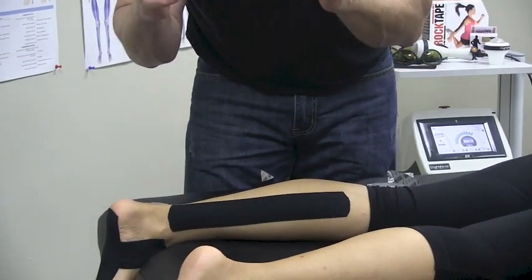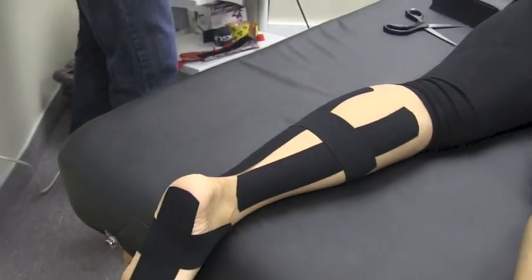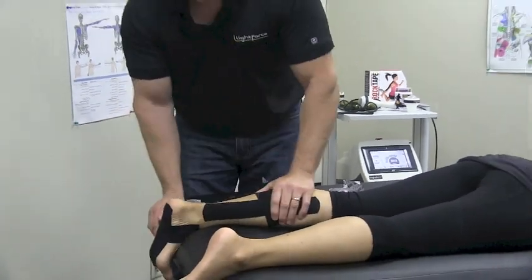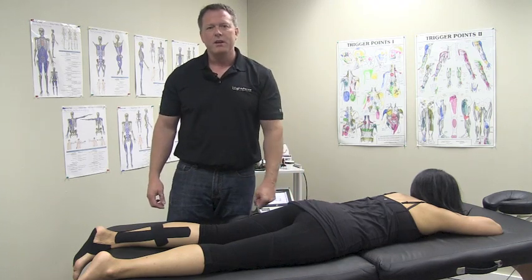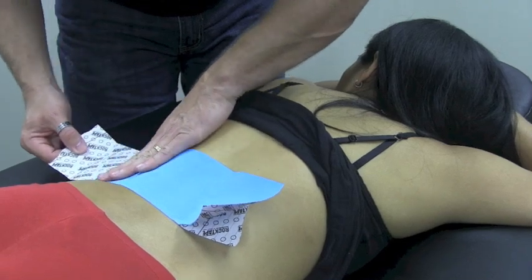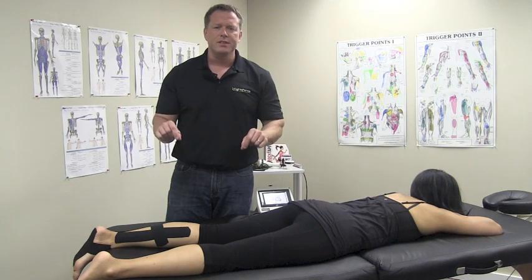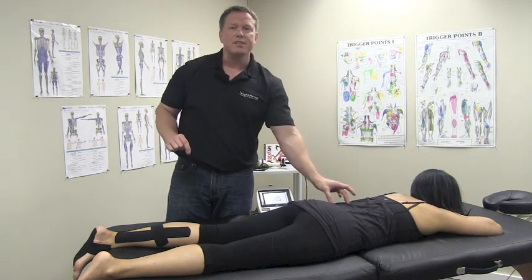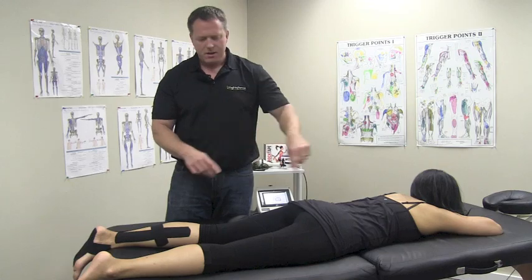Pull a hundred percent, back off half, and place it down. Now they have the support of the tape to give lift and stabilization to the calf to relax the fascia on the bottom of the foot. The last place to tape with plantar fasciitis is the thoracolumbar fascia. After lasering that area, put a four-inch strip of tape across. If you don't have the four-inch strip, just take two strips of two-inch tape and stack them over each other — you'll get the same lift and support to the thoracolumbar fascia that we need for the gait cycle.